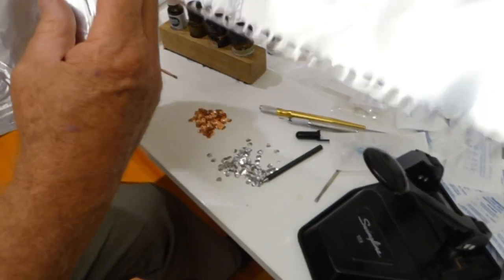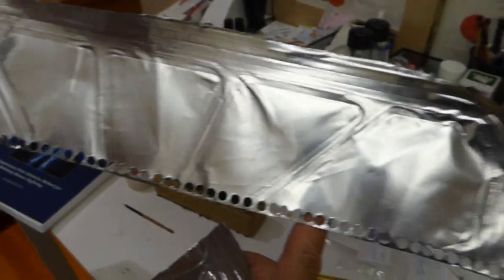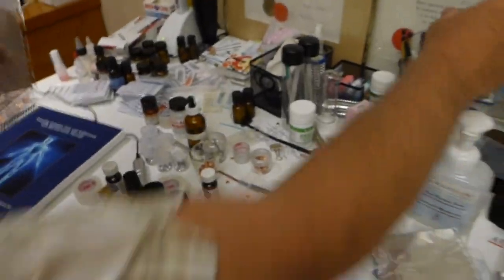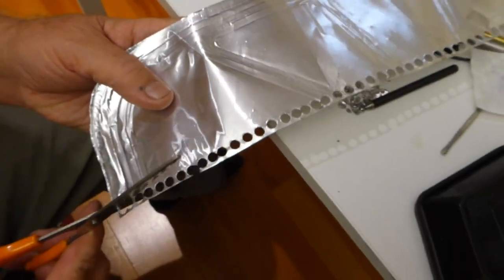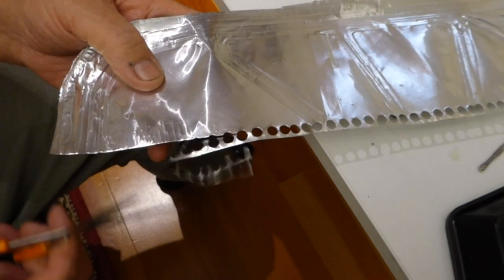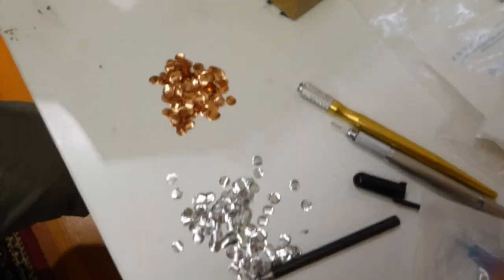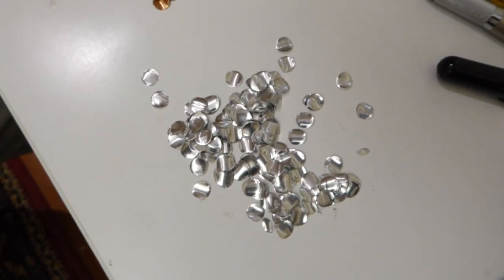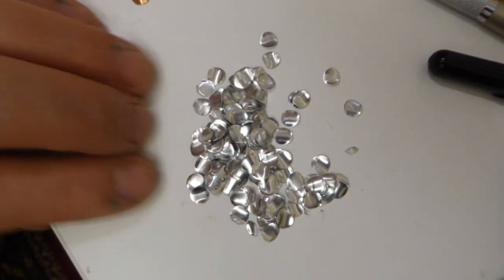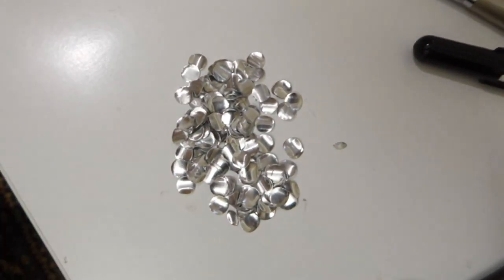Sometimes I get a nice long piece, so I'll just whip along and get that entire row done. Then I simply take a pair of scissors and cut off the excess. Then I start fresh and do it again. And this is the end product — beautiful aluminum electrodes, which work very well for bioelectrode therapy.